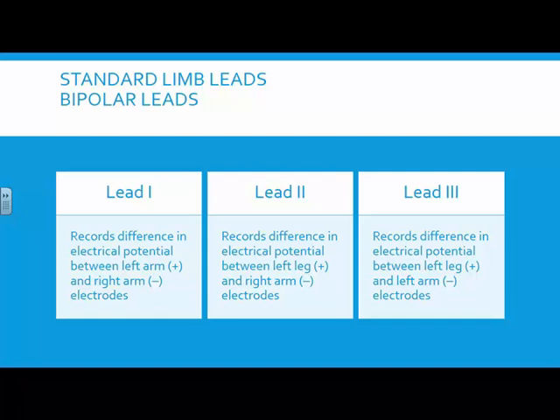So if I were to put the monitor in the lead 1, that would be a setting that I would push. Hey, I want monitor you to read lead 1. I want to see a lead 1 strip. The monitor is going to say, okay, left arm, you become positive, right arm, you become negative.